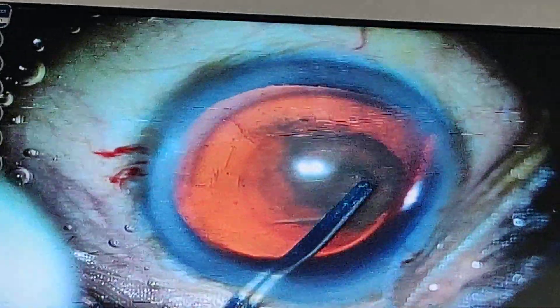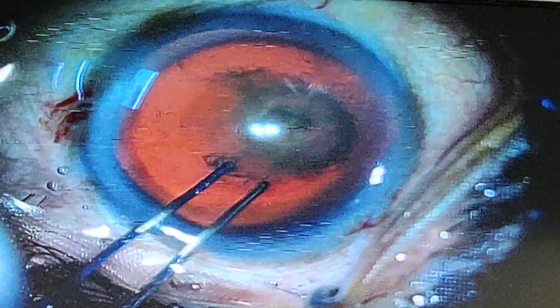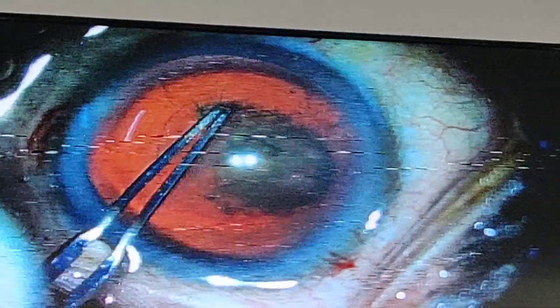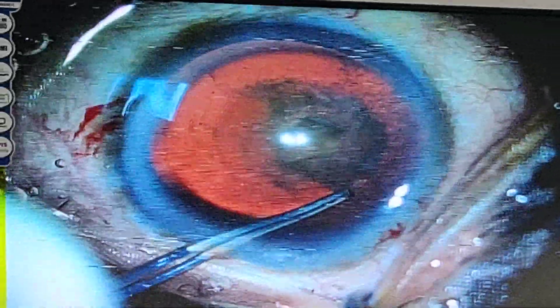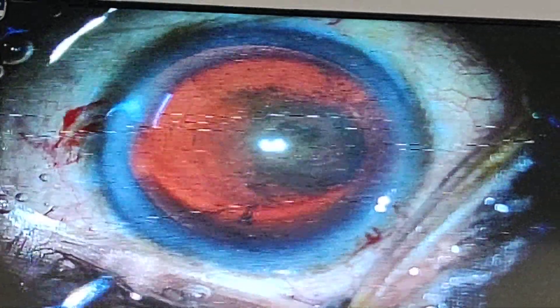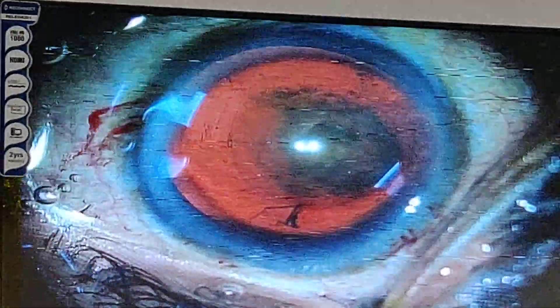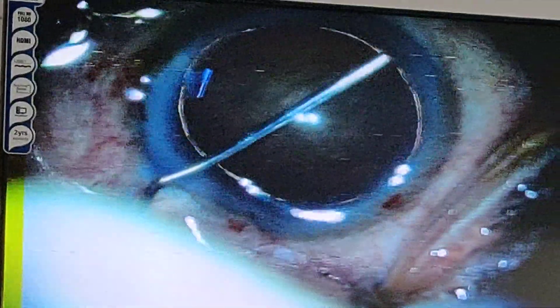This is the capsulorhexis process and you can see the capsulorhexis being done. The size of the capsulorhexis is about 5mm. The beauty of the Lumera microscope is that you can see a very nice red reflex, and it is possible to create the capsulorhexis without staining, using the added illumination.